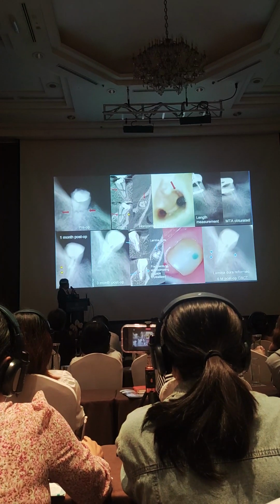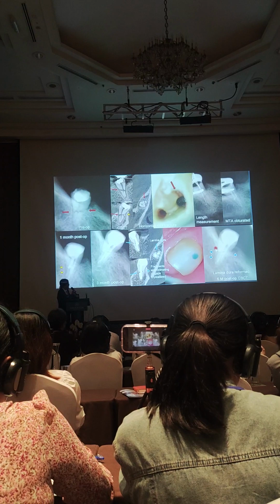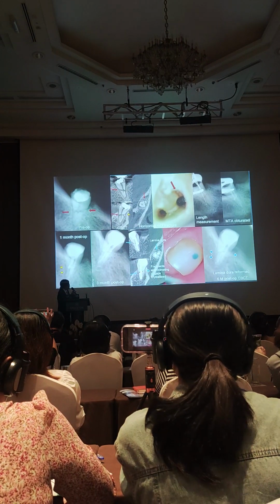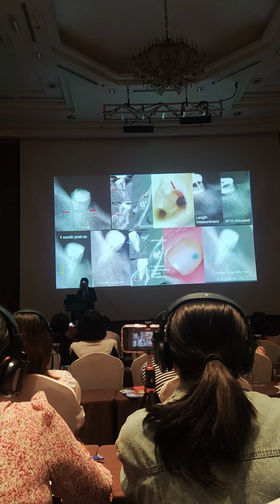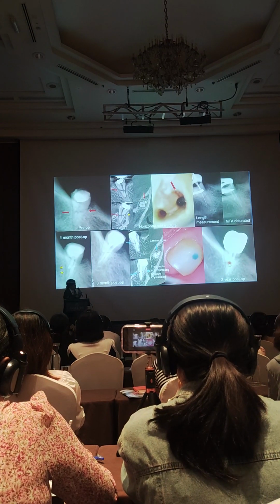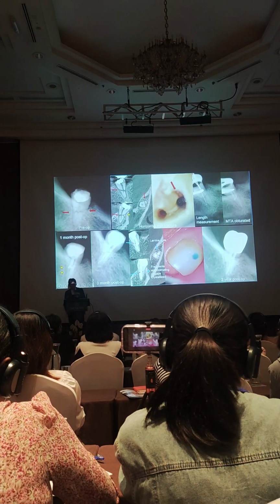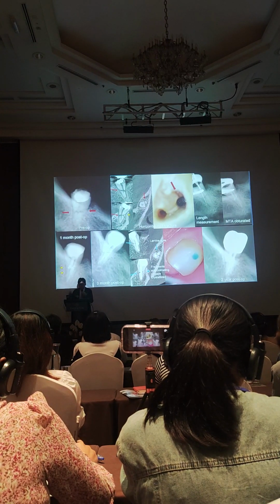And this is 3 months post-op, and this is 6 months post-op, showing nice periapical healing as well as hard tissue formation in the defect. Here, you see the big defect. Now they are completely calcified here. And the tooth was completely stable, asymptomatic. 2 years, you don't see any defect anymore. And the tooth received a coronal restoration, the crown. Then the patient was very happy with the crown. And the tooth was completely functional.